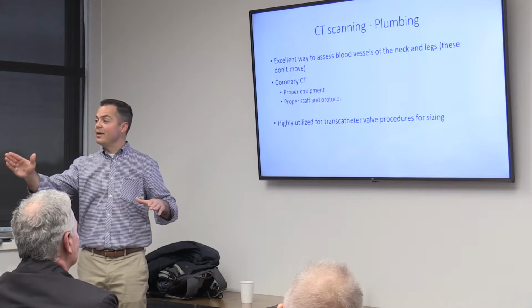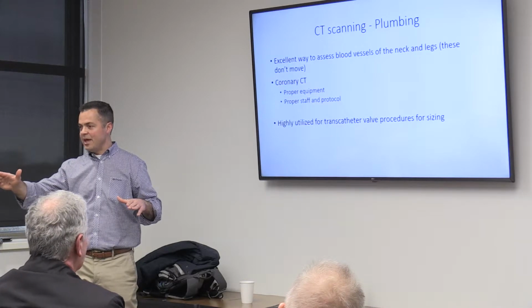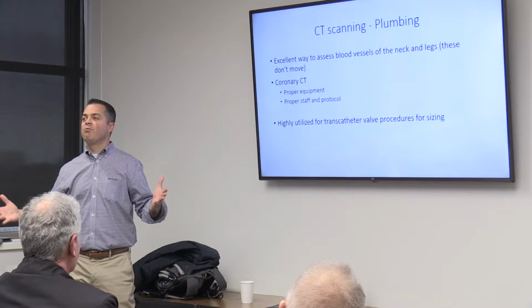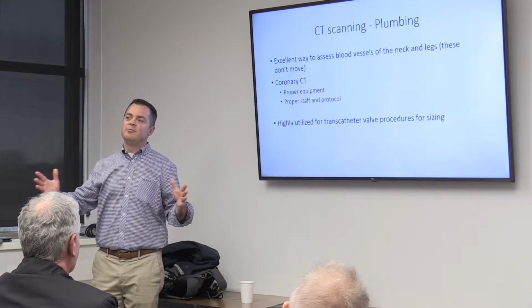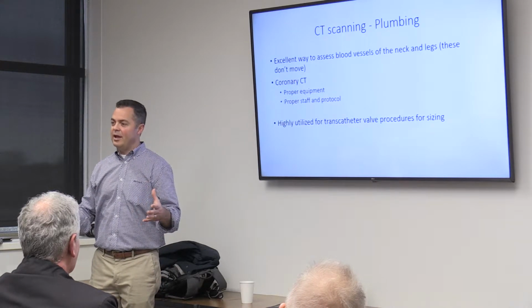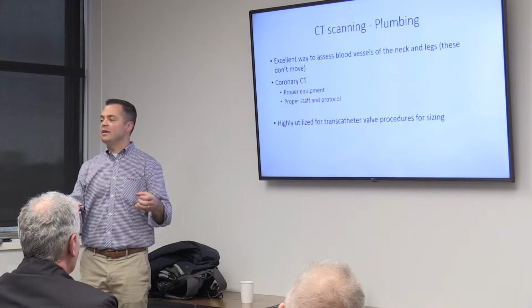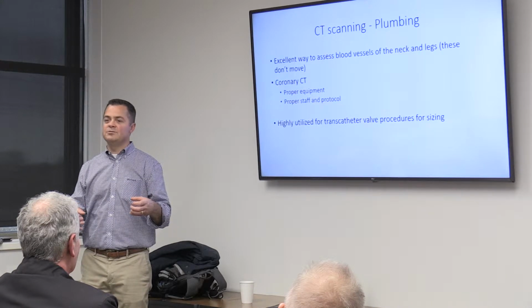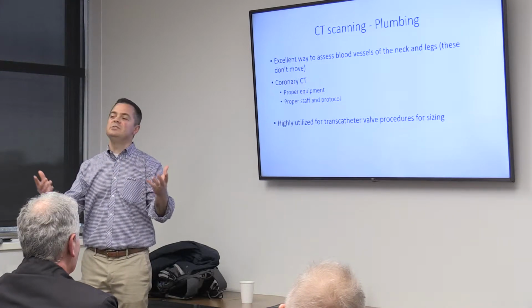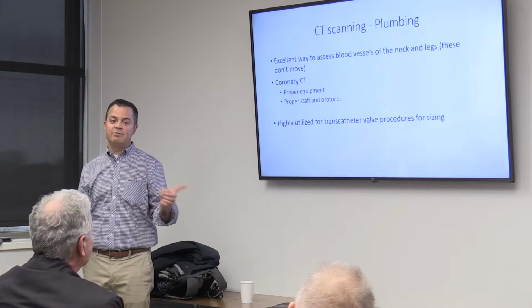But what if we did the same thing and said, all right, tell your heart to stop beating for about 10 seconds while I apply the scan. It doesn't work, right? You can't do that even if you try. So for years and years, people have talked about trying to do CT scans of the heart, but it's a beating thing. And the blood vessels of the heart are kind of small, and the CT scanners weren't fast enough. People would try and take a CT scan, and it would look like a blurry mess. So then you did a CT scan for nothing, right? Well, that's changed. That's different.